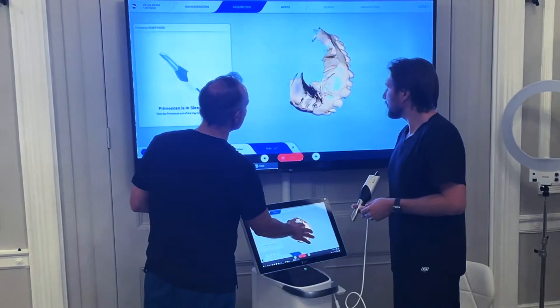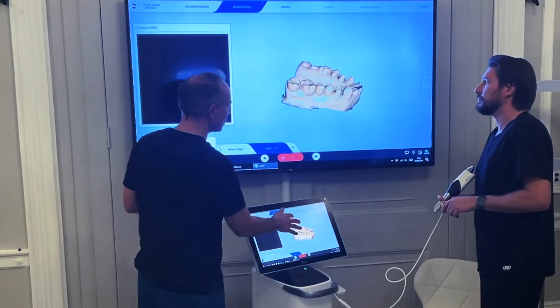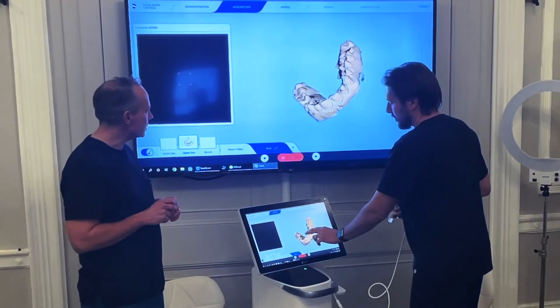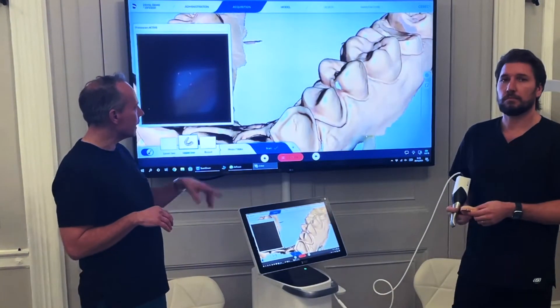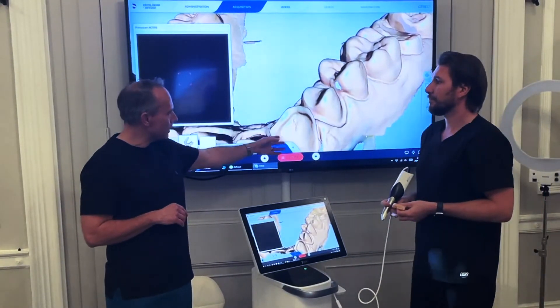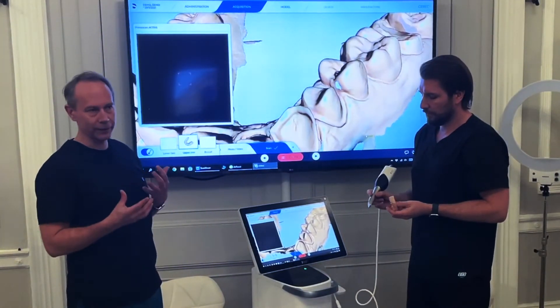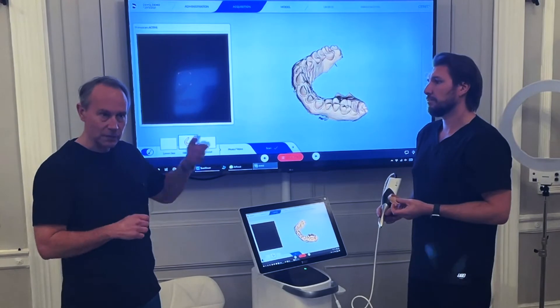Once scanned, even if it looks perfect, you need to check it. The touch screen is really nice for moving the model around and checking from all different angles. Look for any holes in the model because you always want a watertight model. If there are holes the software will fill them in with biogeneric approximations, which we want to avoid. Zoom in and check — a hole near a veneer won't matter much, but a hole in a contact area of a crown will.